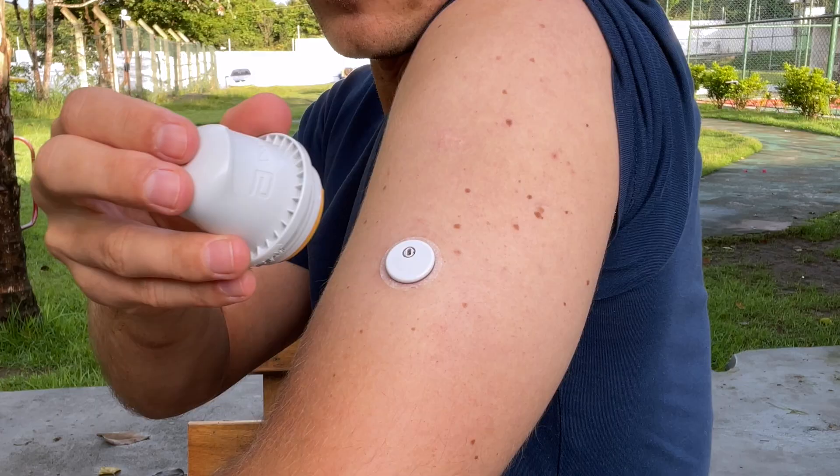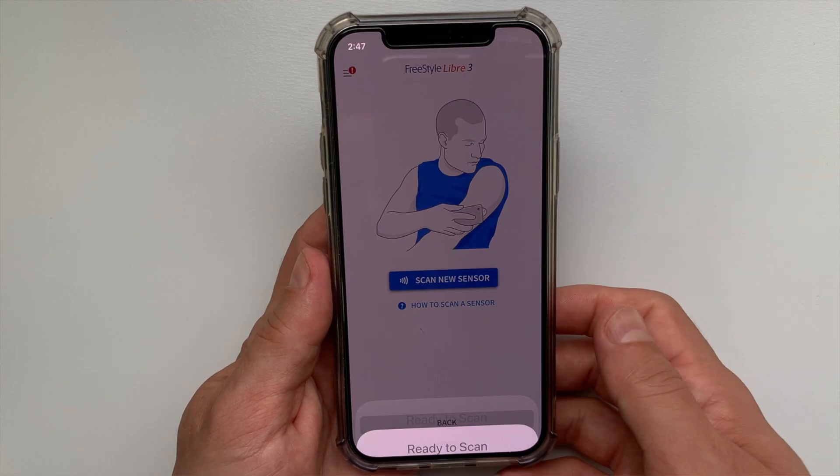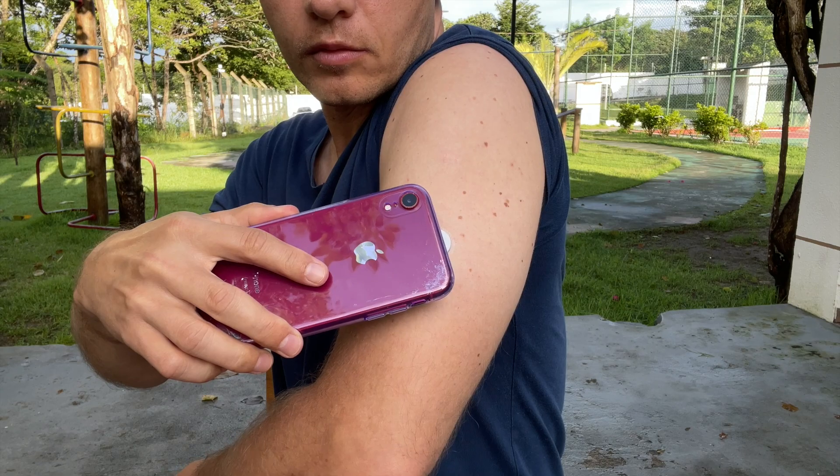Next you need to activate the sensor. To activate it, go back to the Freestyle Libre 3 app on your phone, click on Scan New Sensor, and hold the top of your phone close to the sensor until you hear a beep.